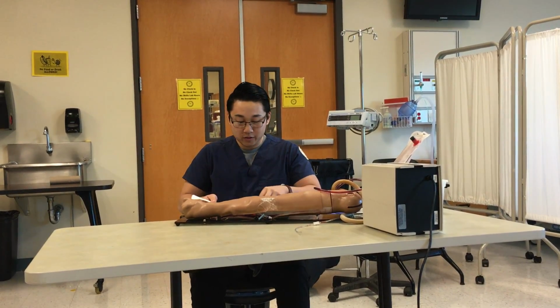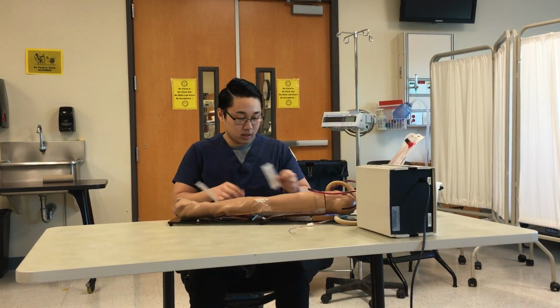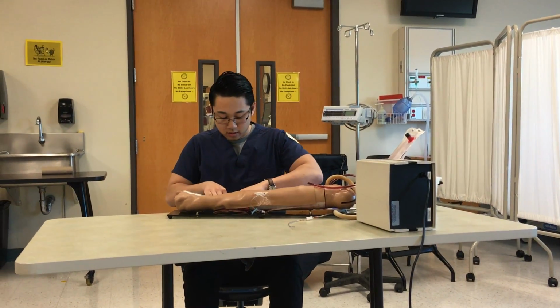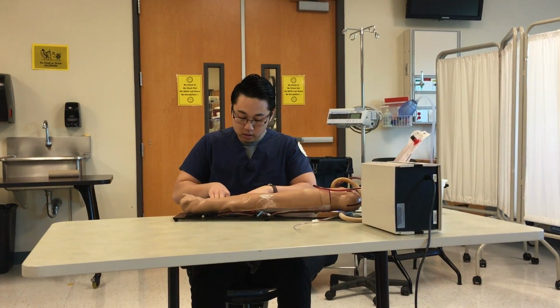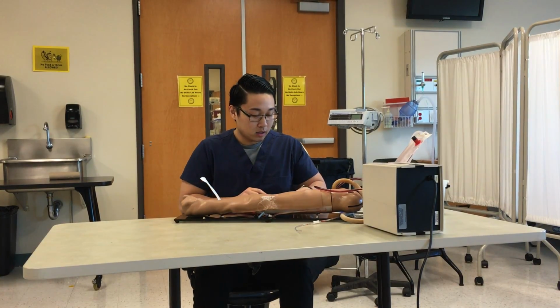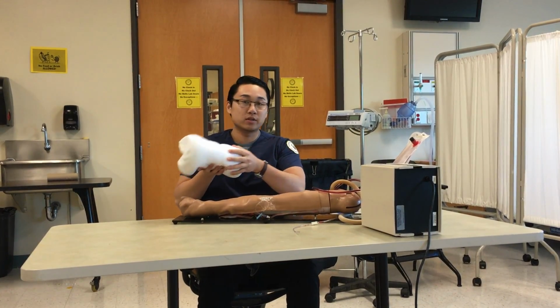And the third step is gathering my equipment. I will have to make sure I get a heparinized needle, a needle cap for protection, gauze, a band-aid, that's optional, a biohazard bag, sanitation solutions such as an iodine strip and an alcohol prep pad, the requisition slip, and the air bubble cap. I'll also get a towel for if you have to hyperextend the wrist, this could be easier on you.